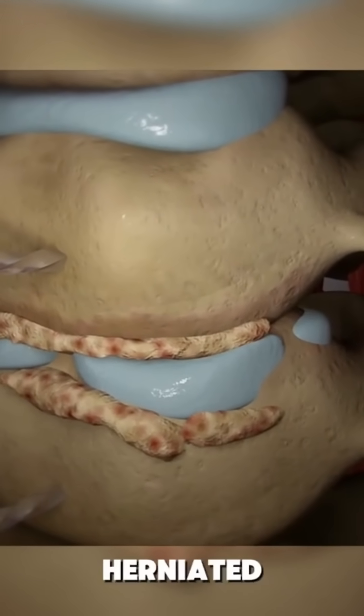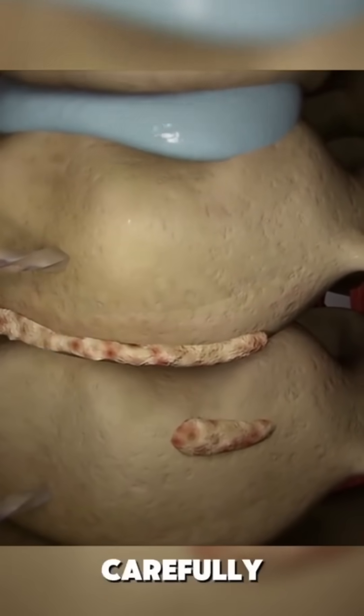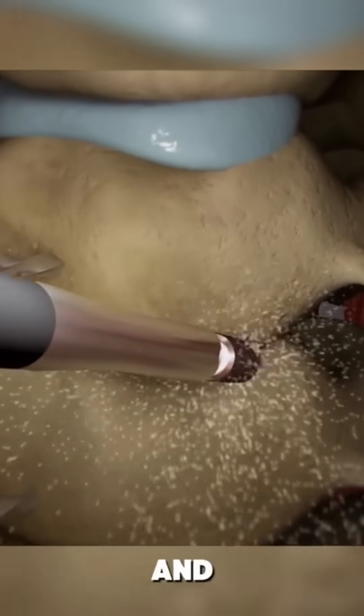The damaged or herniated disc that's pressing on your nerves or spinal cord is carefully removed, relieving pain and pressure.